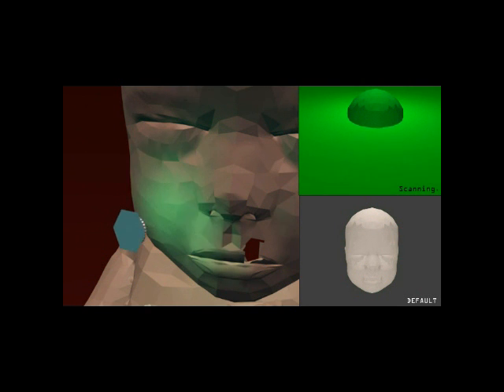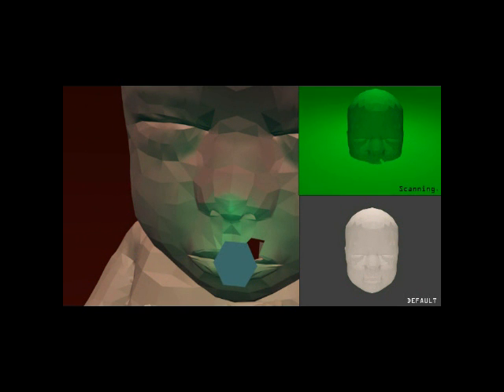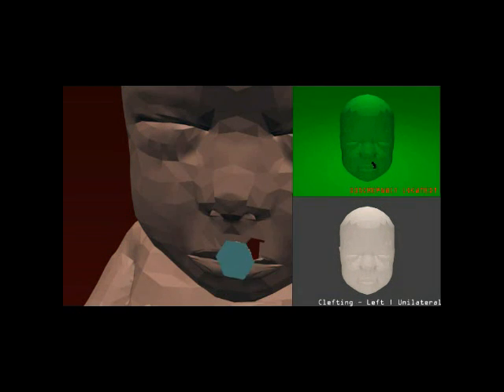MIROR's 3D sonogram device scans the face and palate, comparing the image with a previously recorded default facial mesh. MIROR identifies discrepancies between the images. If a cleft is identified, an origamically condensed, watertight surgical environment is deployed around the cleft.